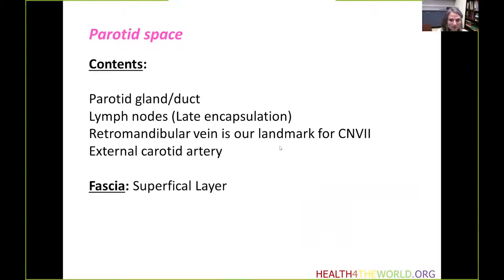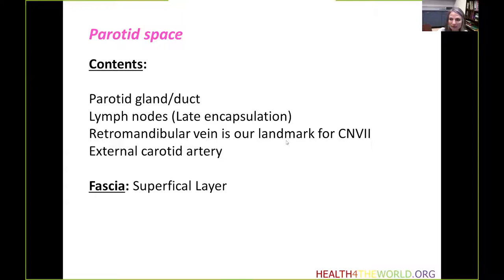Moving on to the parotid space. Its contents include the parotid gland and part of the duct. Some lymph nodes are normally seen within the parotid glands due to late encapsulation during development. The retromandibular vein is seen within the parotid and is a radiological landmark for the facial nerve, which subdivides the parotid into the superficial and deep lobes. Branches of the external carotid arteries are found within the parotid space as well.